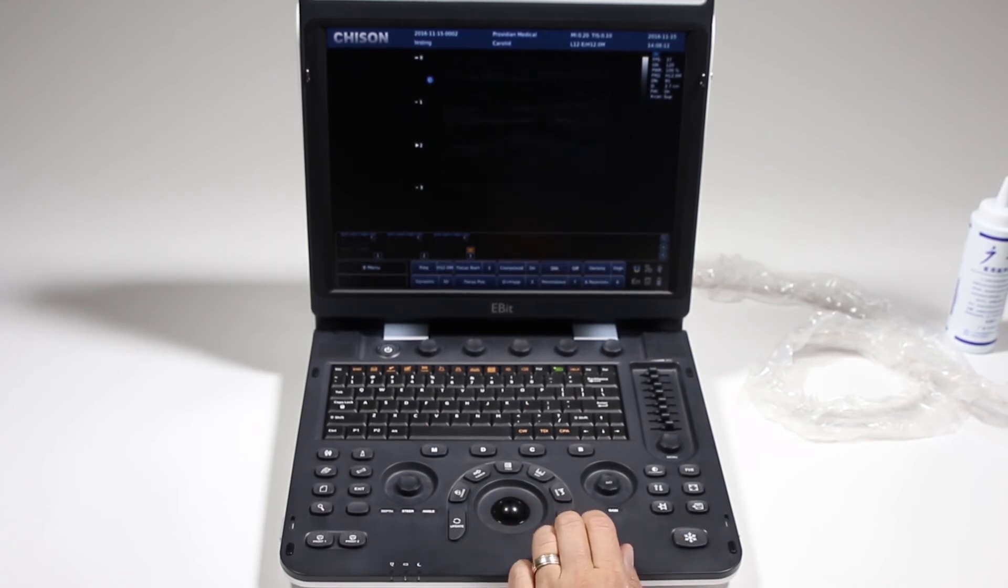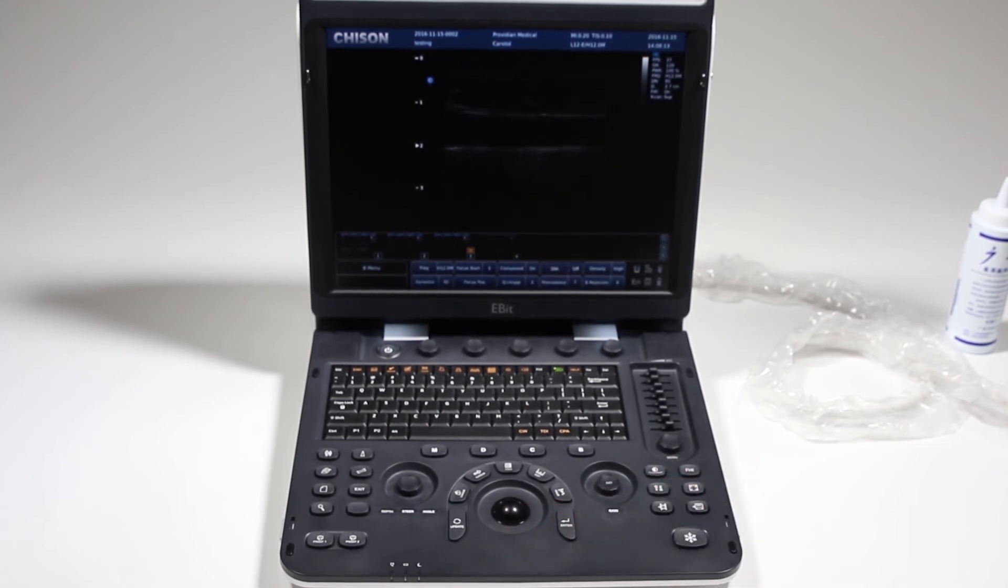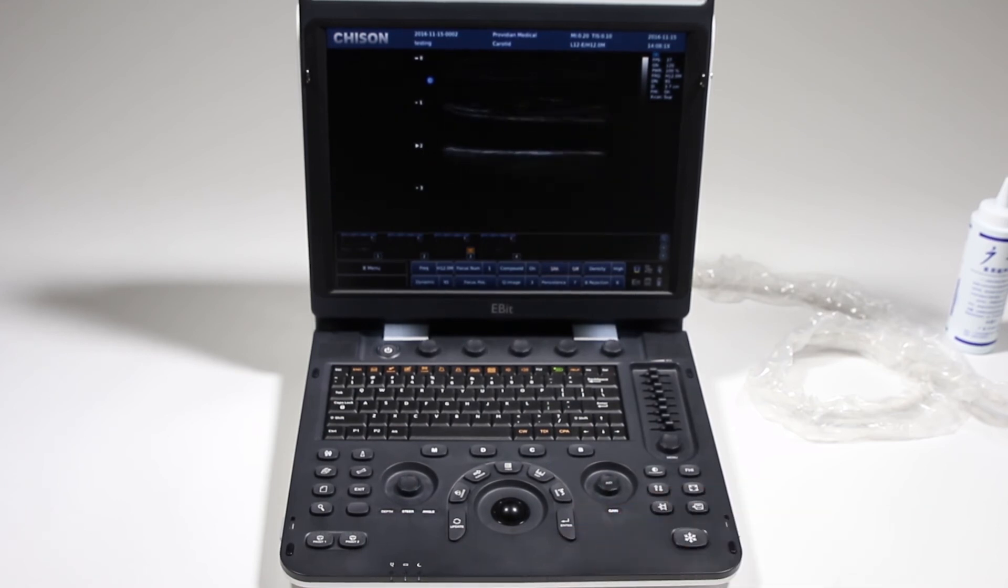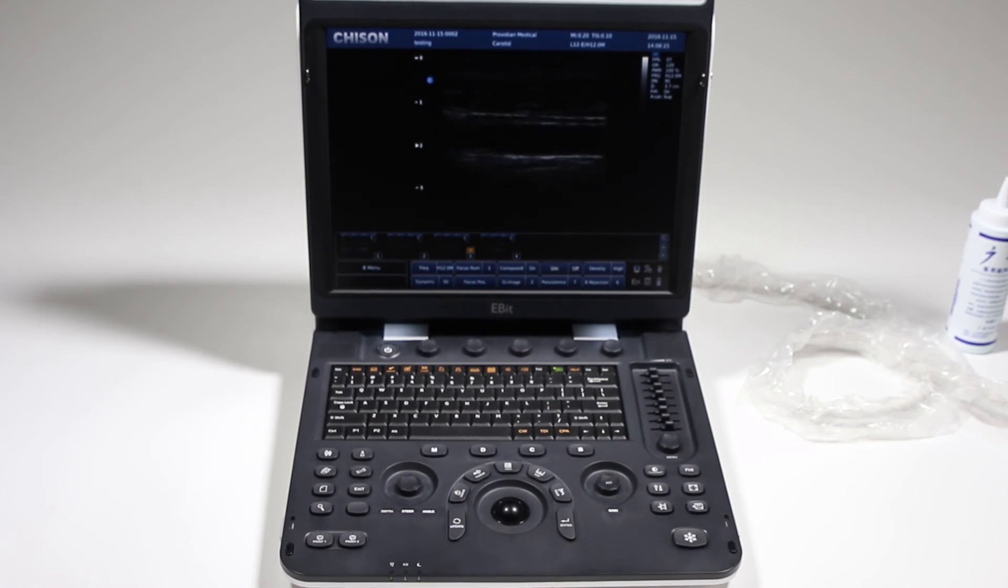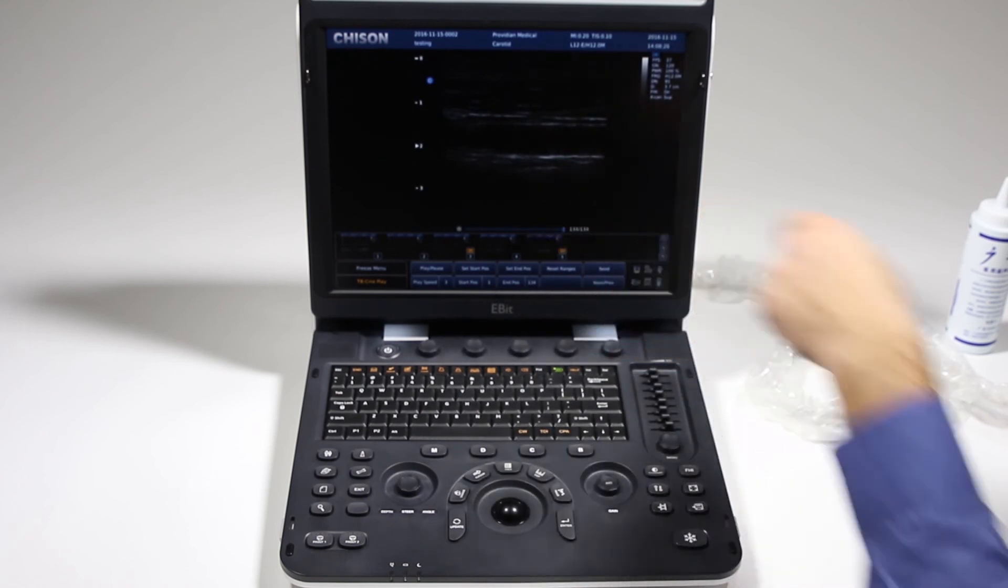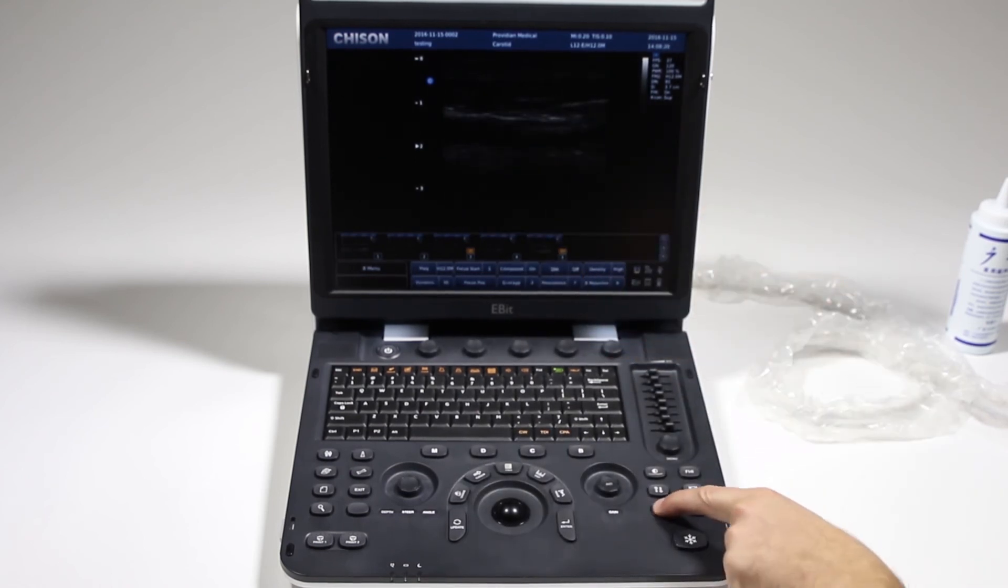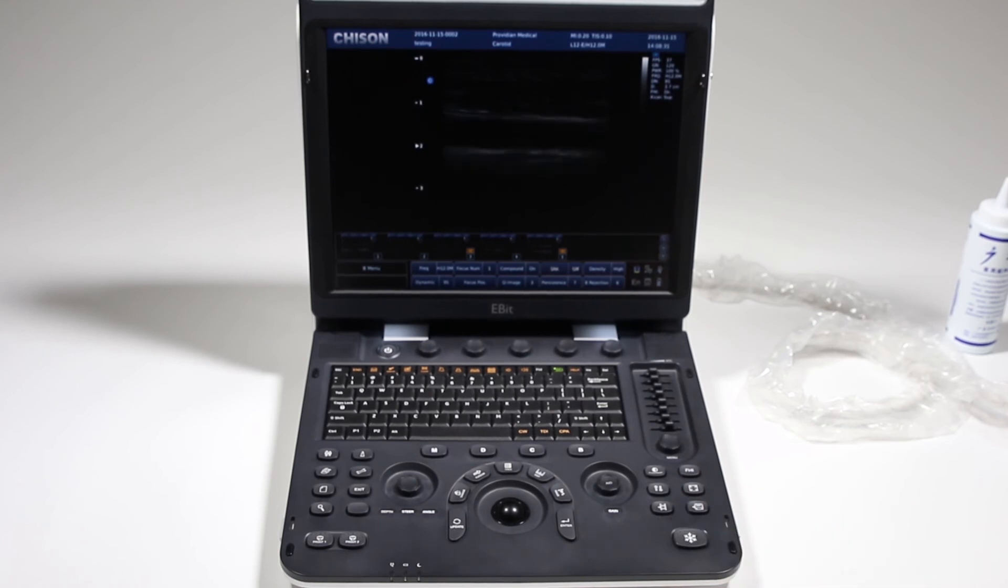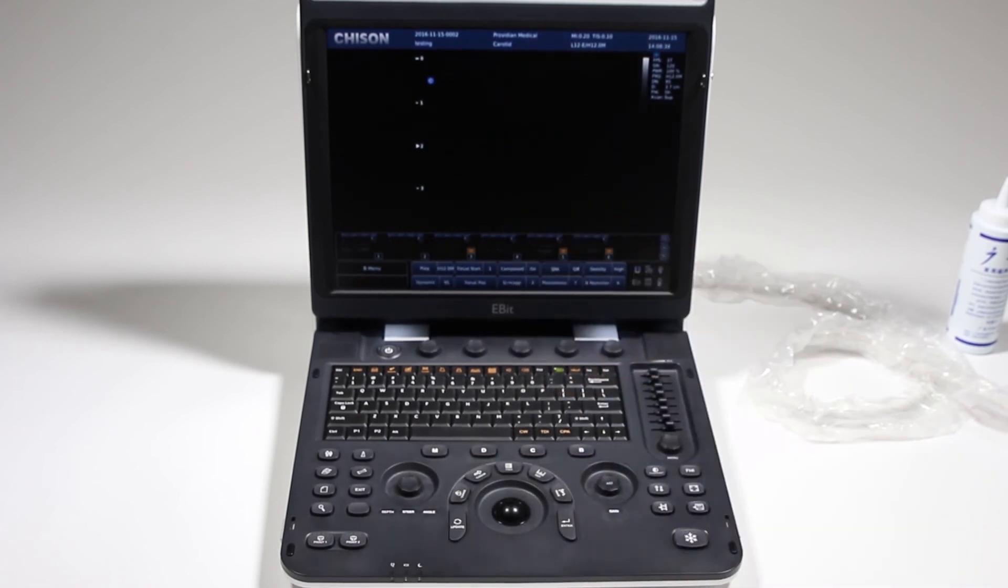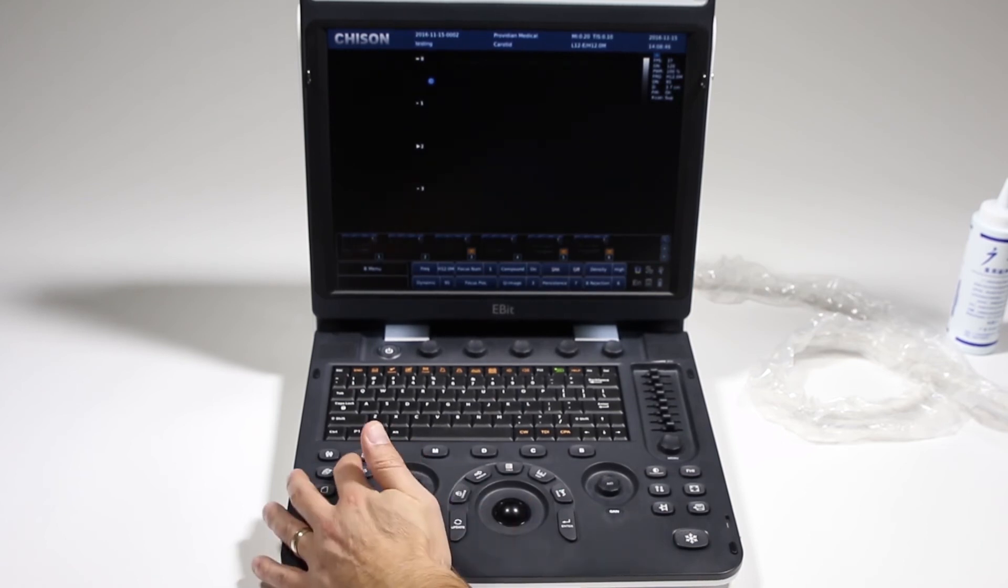I can also do what's called prospective. I can be in a live image, I can save a single image and it's going to save whatever was right there on screen. Then I can also press this cine loop and it saved whatever I was looking at on that screen. If I press this down, the color will change to show that it's recording. It's going to show whatever I'm looking at right now. It froze and it saved those 133 frames. That can be preset to a certain number of seconds as to how the prospective saving is done.